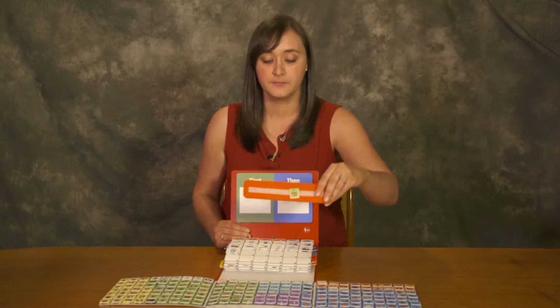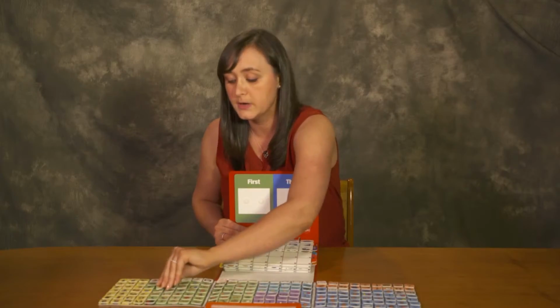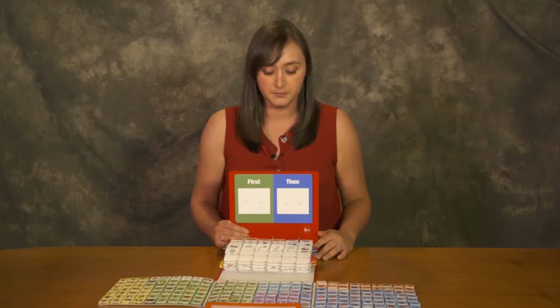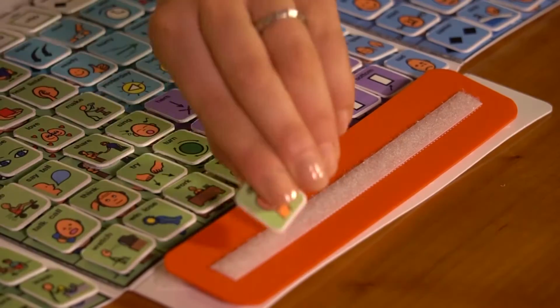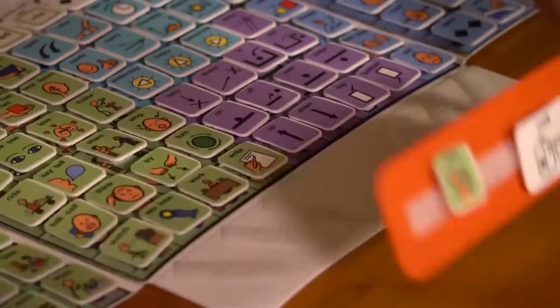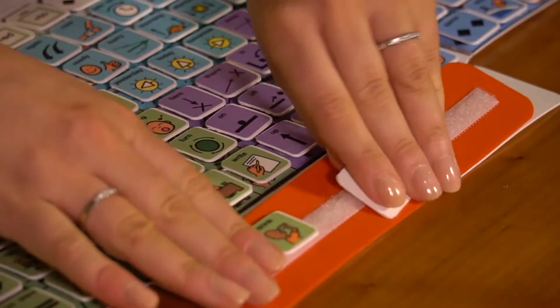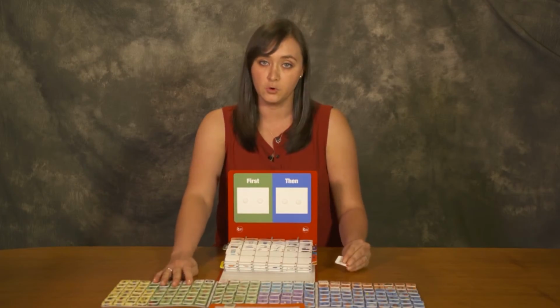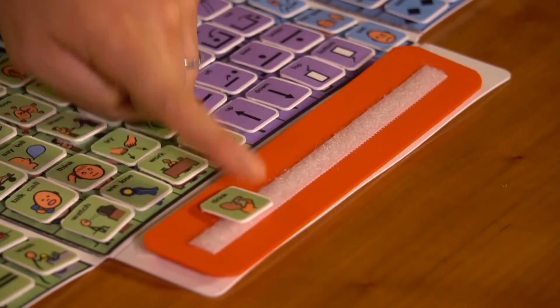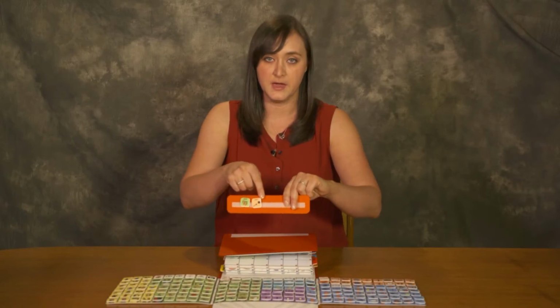by itself. If the child is working at the two-word level, they may put two-word combinations together on the core communication card. Using that same example of milk, the child may pull down the word milk, or drink and milk. Drink milk. Or the child may use only icons from the core vocabulary foldout and put those together. Child may say drink that.